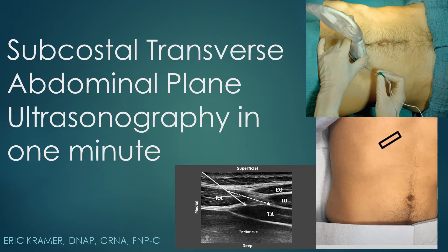The subcostal TAP varies from the midaxillary TAP because of the involvement of the rectus abdominis muscle. When you first put the probe on in this orientation, you will probably see the rectus abdominis muscle with the transverse abdominis muscle underneath it. The fascial plane in between those two is an acceptable location to deposit your local anesthetic.